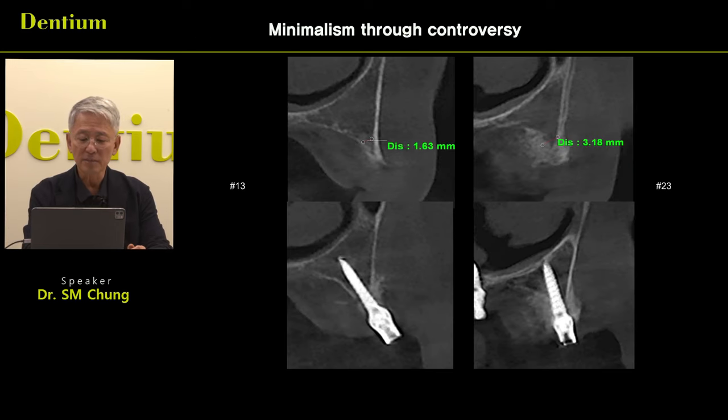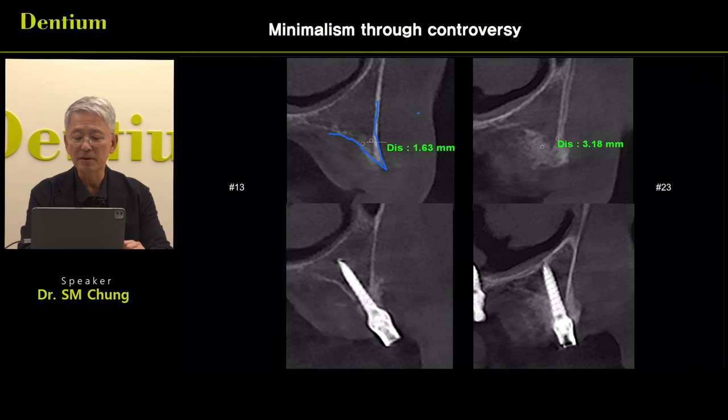So we placed very narrow diameter implants in the very thin alveolar ridges, together with bone graft. As you see, the alveolar ridge is very thin, very common with a complete denture patient. At first, with a little bit of augmentation, we placed the very narrow diameter implants, and we can also see osteoporosis on this side. So it was a very difficult implant treatment for the edentulous patient.